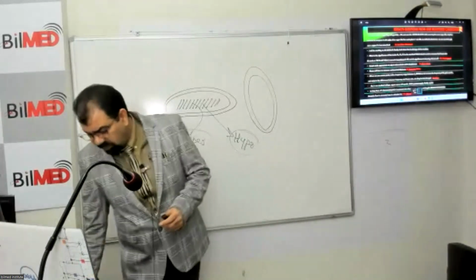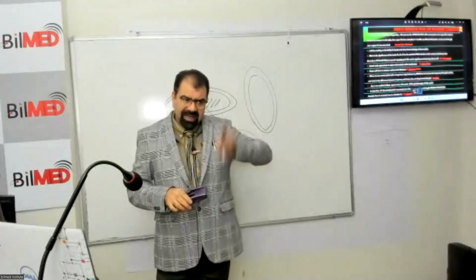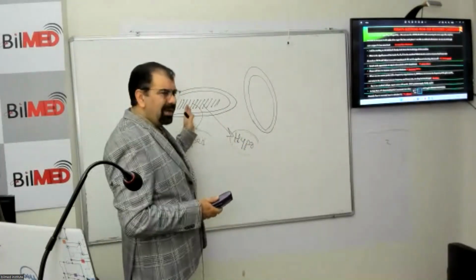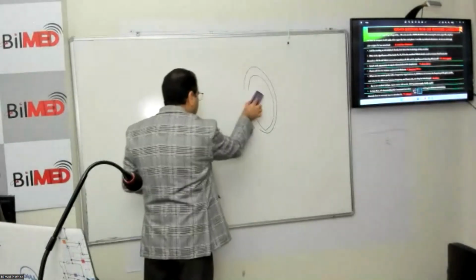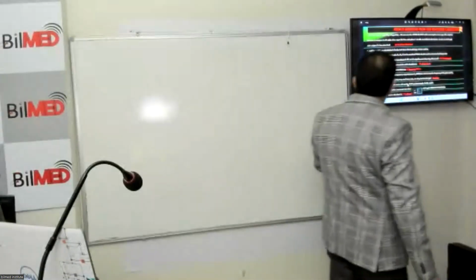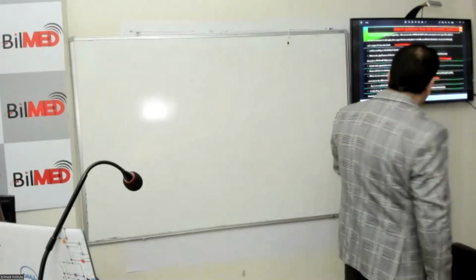So see how the lymph node is in body, vertical or horizontal, and see for the central part whether it is hypo or hyper. Of course, you will put a Doppler also, I mean the color, to see whether it is more vascular. That will be topping up the diagnosis. So this was the reply to the question posted by Dr. Shipra. Now, next question. Please tell me how to measure endometrial thickness by Dr. Taranum Akhtar. How to measure an endometrial thickness?